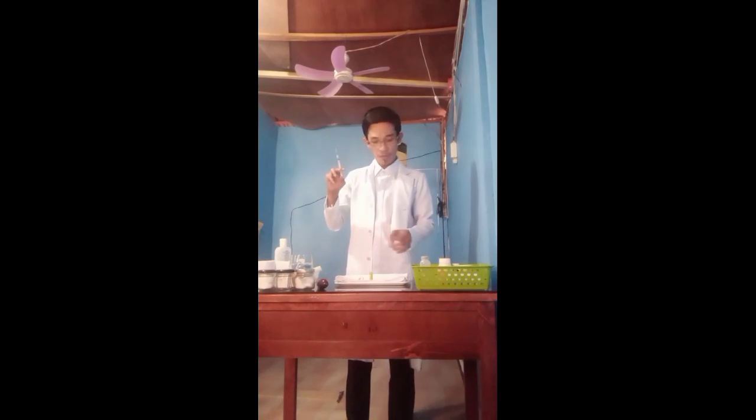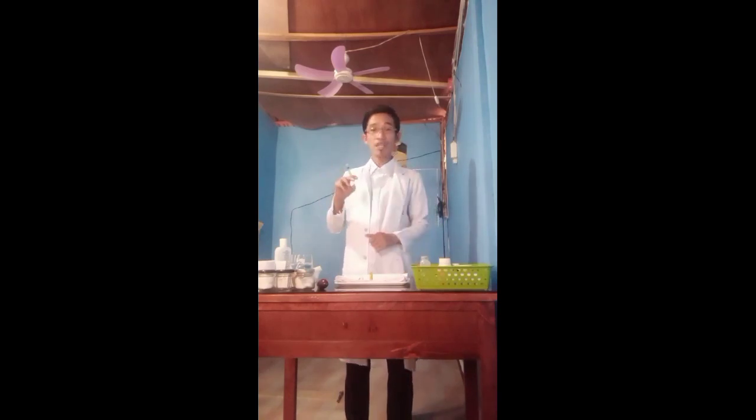So I have already the 0.5 milliliter, to ensure the medication is expelled correctly. So next is to scoop the needle to recap, to prevent injury. So this is returning the cap.